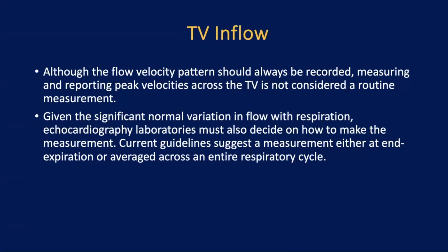But you don't know what will happen in the future. They said you should pulse it in the guideline. But what's the parameter to use? It depends on the lab. What do you want to record? Okay, but to pulse the inflow, it's part of the study.